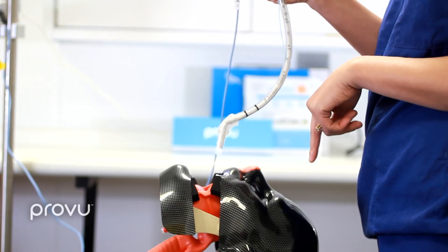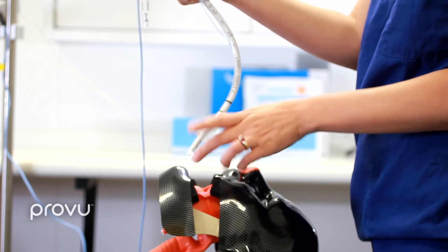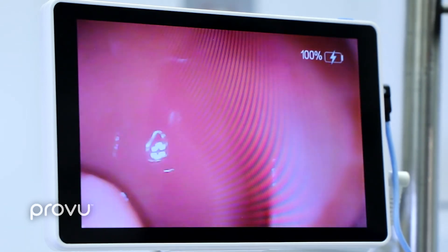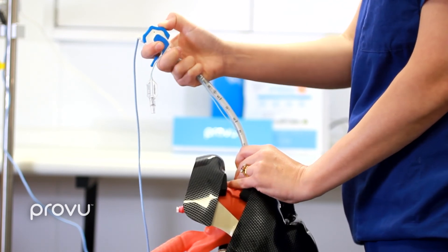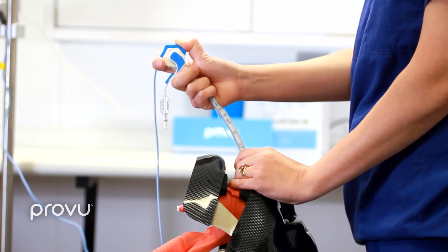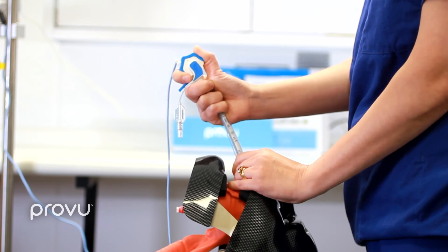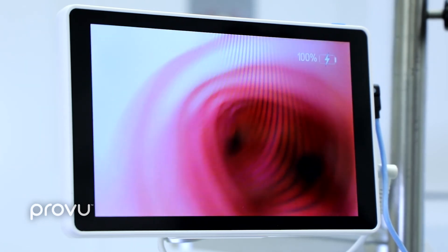I'm going to use the ProView video stilette as a sole intubating device in the traditional setup, standing behind the patient, using my other hand just to guide tube placement as we come into the mouth. As you can see, we've got the uvula there and I'm just beginning to see the epiglottis. I want to move behind the epiglottis, so I'm using the bi-directional wheel as I go. I'm flexing the tip to look up and under the epiglottis, and as I come into the trachea I use the retroflexion to look down the trachea, keeping the tube in the centre of the trachea as I go down. Now I can see the carina in the centre of my view.